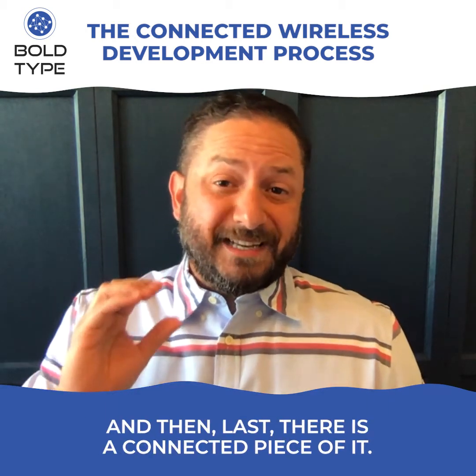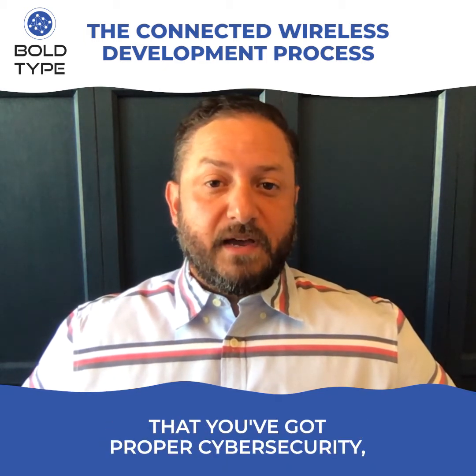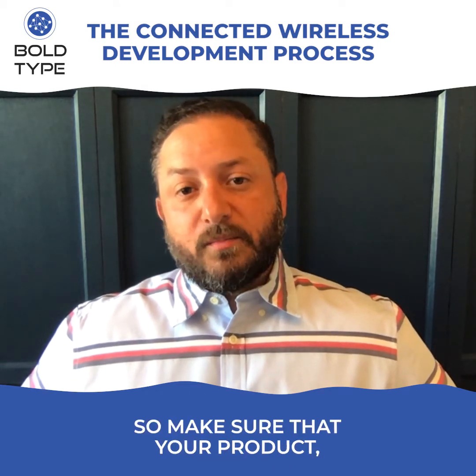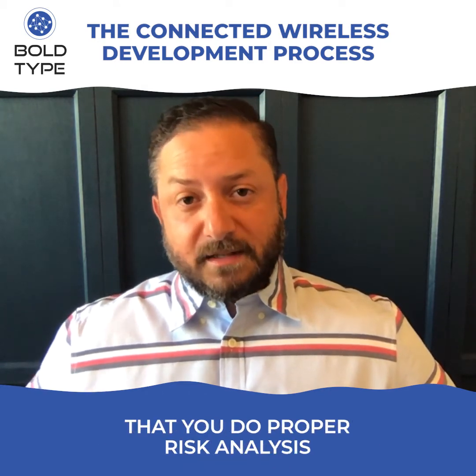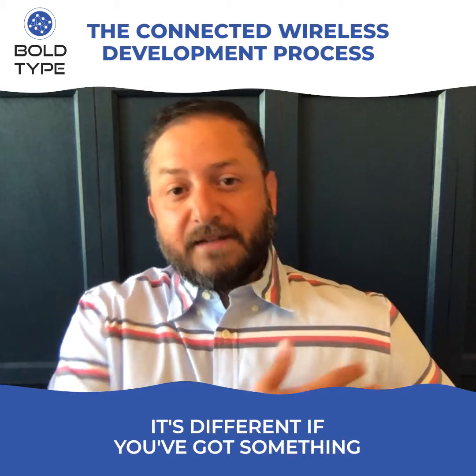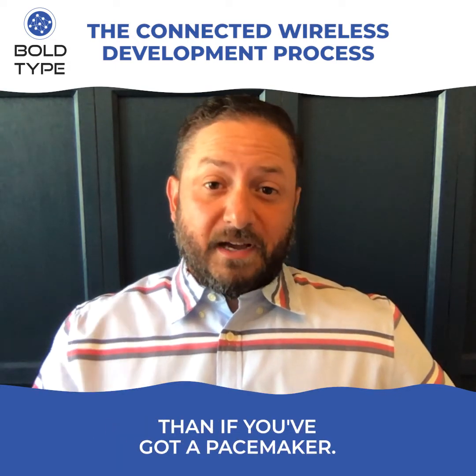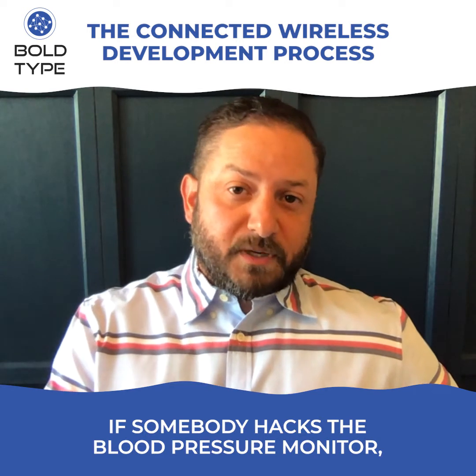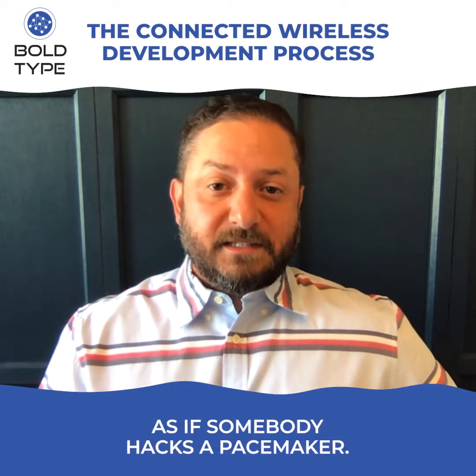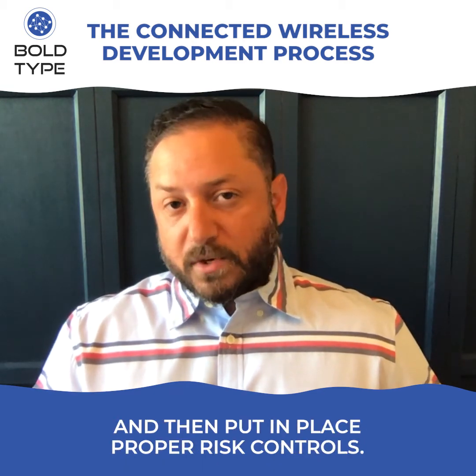And then last, there's the connected piece of it. So you're connecting to the cloud, and you have to ensure that you've got proper cybersecurity, really, really important. So make sure that you do proper risk analysis on your product and you mitigate for any potential risks. It's different if you've got something like I mentioned earlier, like a wireless blood pressure monitor, than if you've got a pacemaker, right? If somebody hacks the blood pressure monitor, the risks associated with that are not as high as if somebody hacks a pacemaker. So you have to do proper risk analysis around that and then put in place proper risk controls.